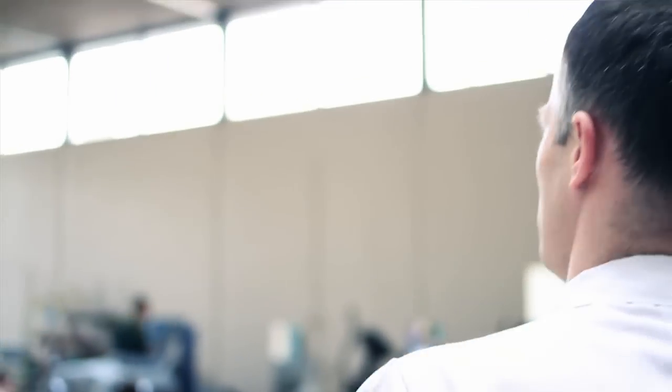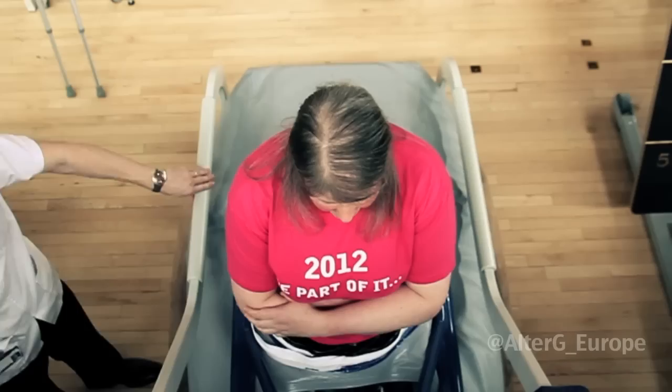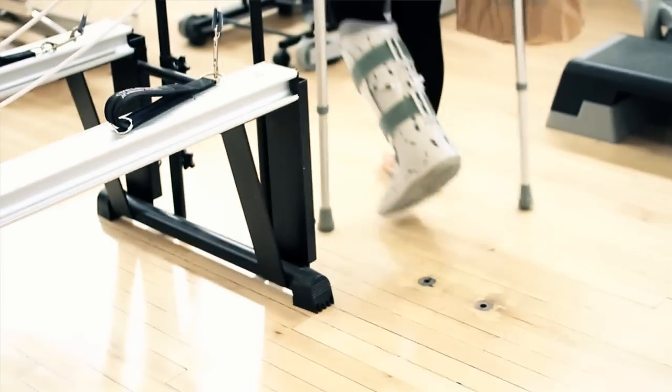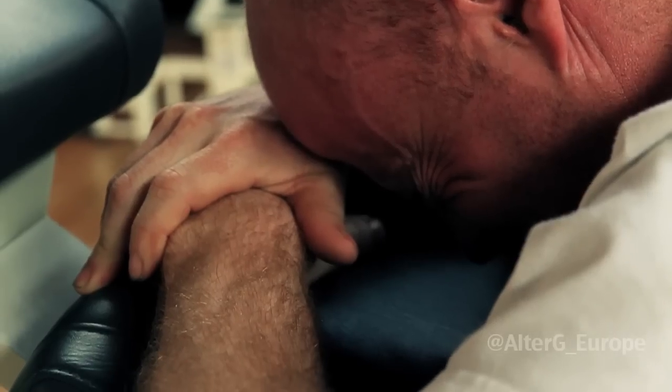My name is Louis O'Connor, I'm the clinical lead physiotherapist for the regional trauma unit at the Royal Victoria Hospital in the Belfast Trust. We've had the AlterG on loan for the last three months and during that period we've had a number of patients who have trialled the machine — from ankle injuries to knee injuries to hip injuries to pelvic injuries, but there's also been a number of patients with neurological weakness, patients who have had strokes, patients who have had head injuries and medical issues. Close to nearly 200 patients have trialled it during the three-month period.